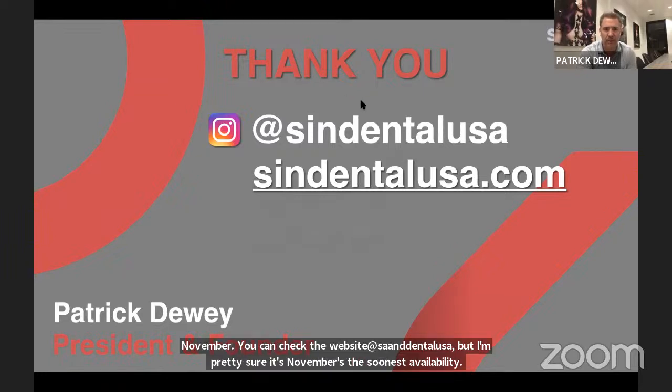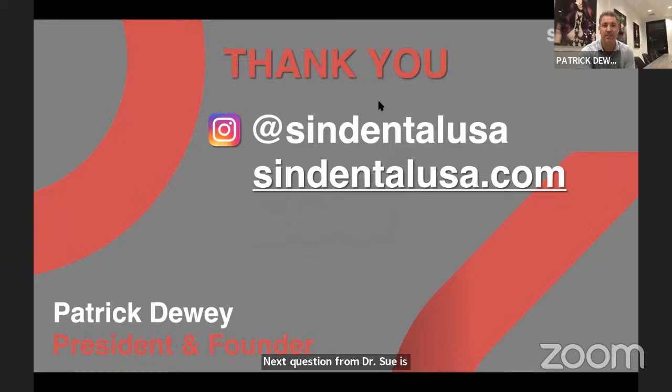Next question from Dr. Sue, is it compatible with other implant systems such as Dentsply Astra implants? Another great question. I'm assuming you're referring to the specific photogrammetry components. So the photogrammetry device, the micro mapper, it doesn't matter what implant system you are. However, you are limited to what's considered the Nobel standard multi-unit platform. So if your multi-unit system is a 4.8 millimeter platform, Nobel Biocare, BioHorizons, SIN, Neodent, 3i, most out there are.